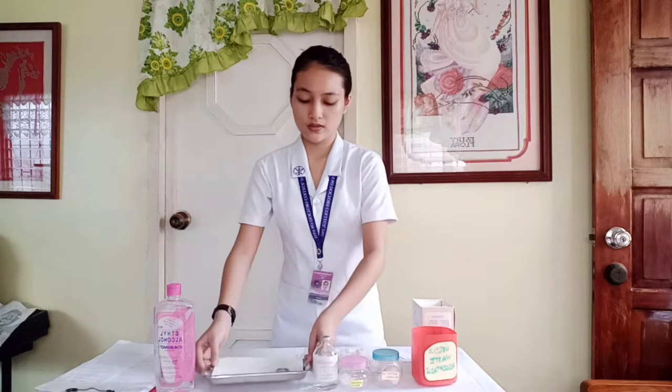I have a hypodermic tray and forceps, and most importantly, I have waste receptacles here. This is where I will dispose the used needles and syringes so as to avoid needle prick injuries.